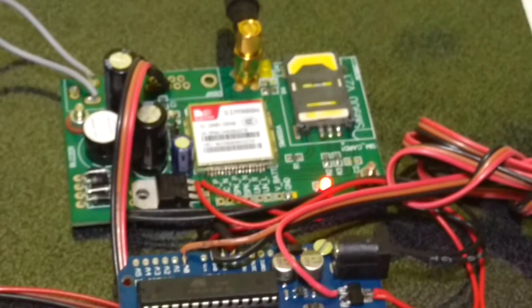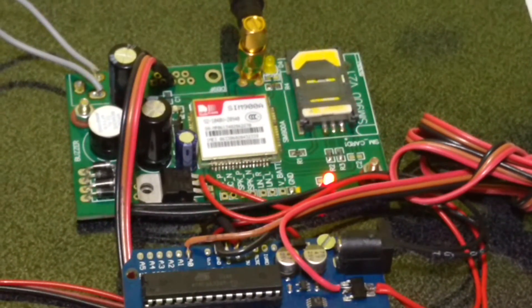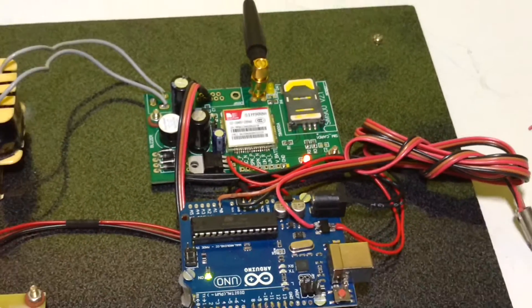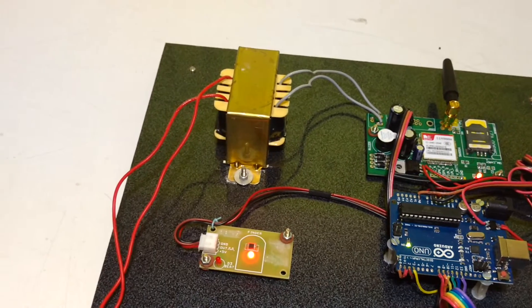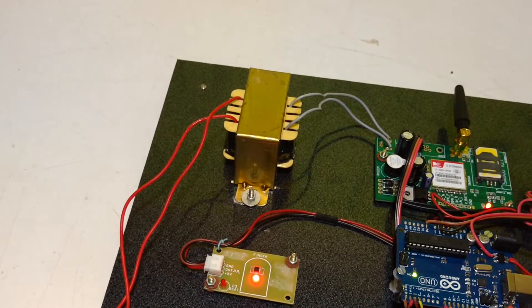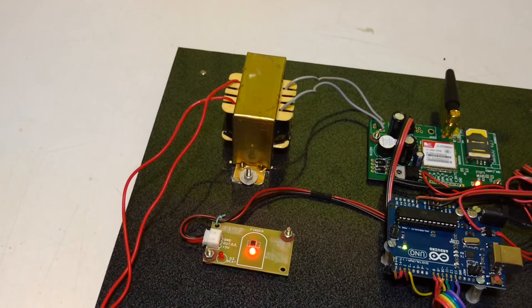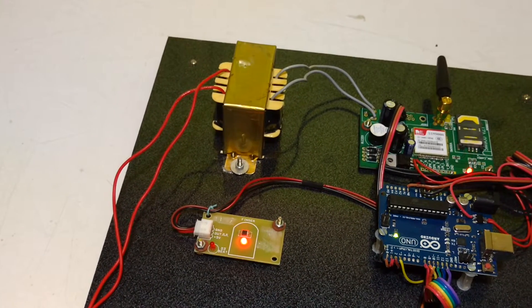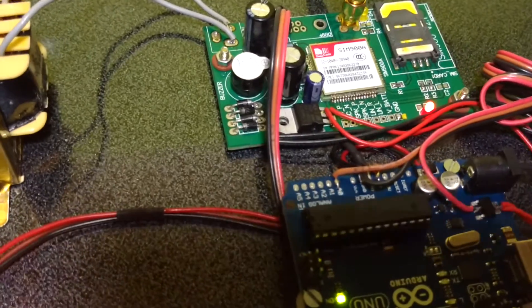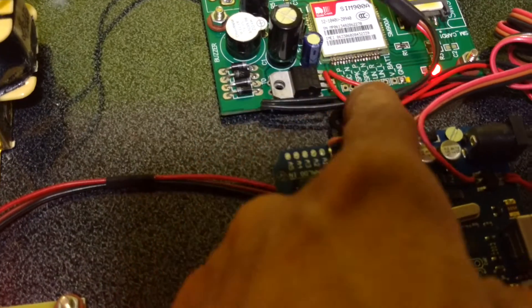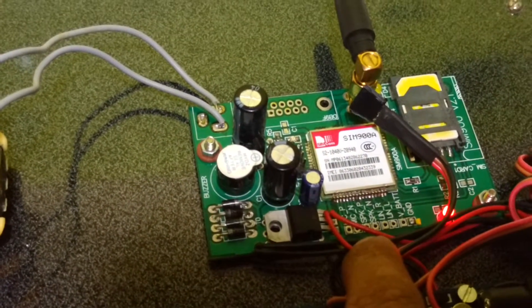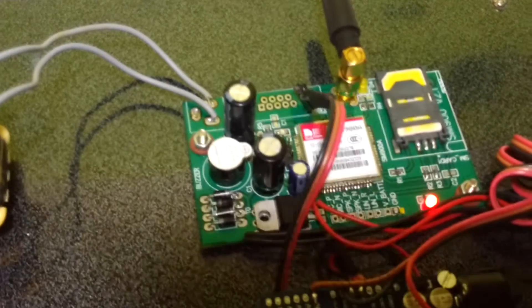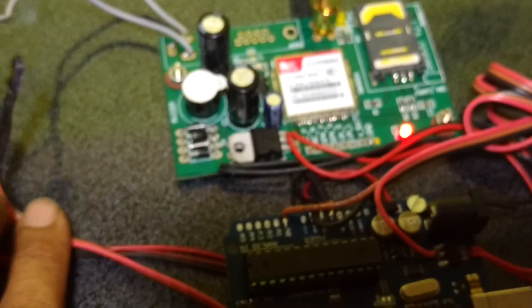We also implemented GSM modem SIM 900 for GSM connectivity. 12 volt secondary transformer which converts 230 volt AC to 12 volt AC. That 12 volt AC will be rectified by this bridge rectifier and filtered by these two filter capacitors.